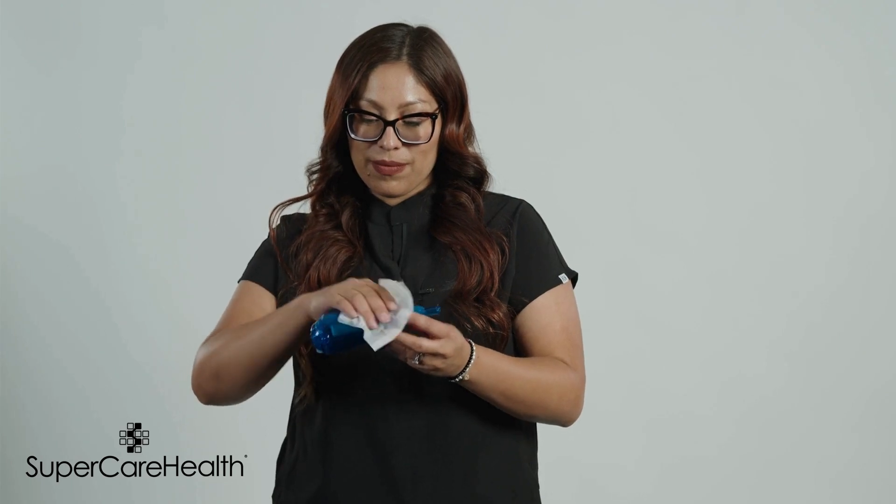Proper cleaning and maintenance of your equipment is essential for both hygiene and performance. Please note that the flutter valve should be replaced every six months. There are multiple ways to clean or disinfect the flutter valve. Do not bleach. Do not microwave. Visually inspect the device to ensure that the unit is free of contaminants and foreign objects.